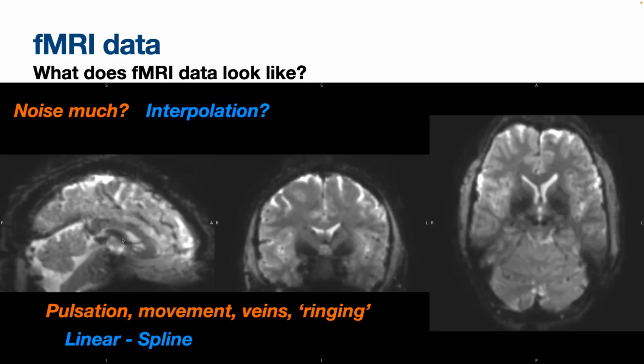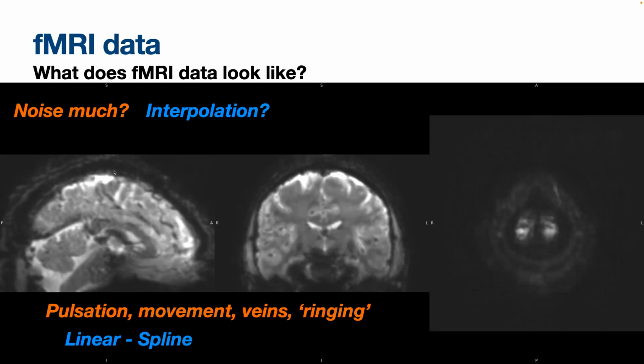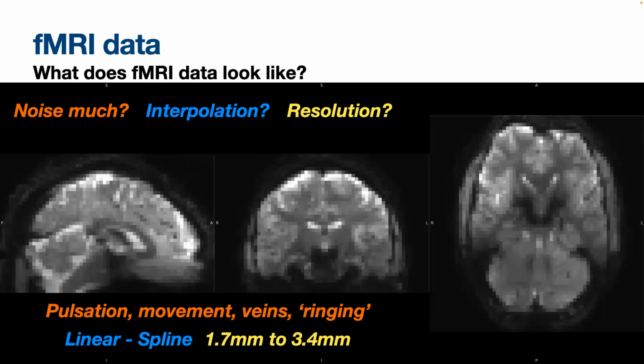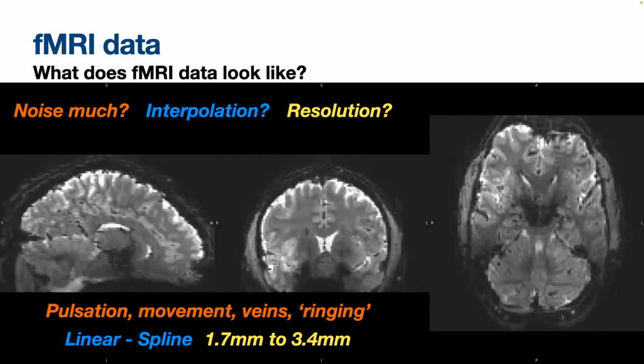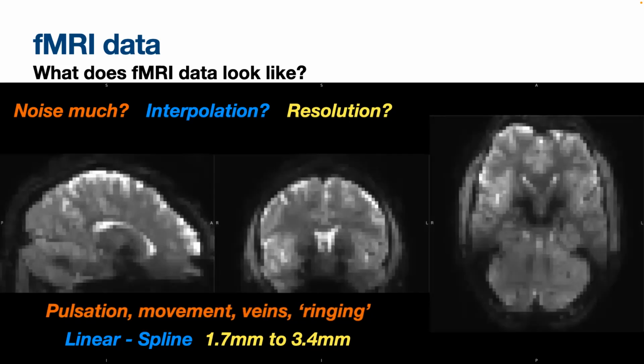Yeah. So how long does it take to find it? Yeah. So here, every image is taken 1.6 seconds. Yeah. So here, the original data, which is the high resolution, the fine detail data, is a very exquisite 1.7 millimeters for every voxel. So it's small for a functional imaging thing. And for us, the sweet spot for a whole brain acquisition, we can do around 1.5 seconds, a little more than 1.5 millimeters. So you get a lot of spatial detail and you get a reasonable temporal resolution to perform functional MRI analyses on.